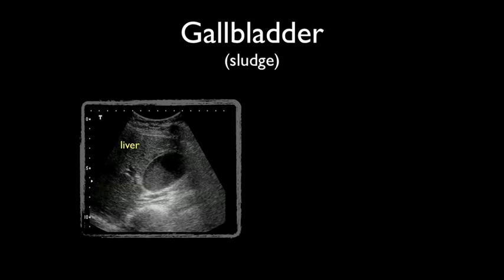Sludge is especially common in hospitalized patients. However, sludge may also be seen in patients with obstruction of the cystic ducts or more distal bile ducts. Sludge does not cause acoustic shadowing.